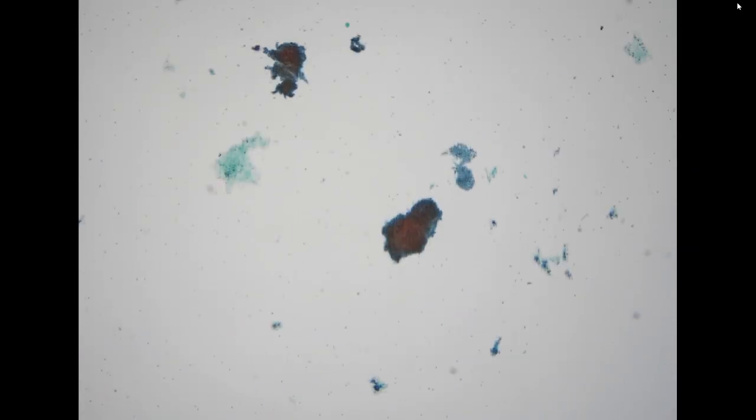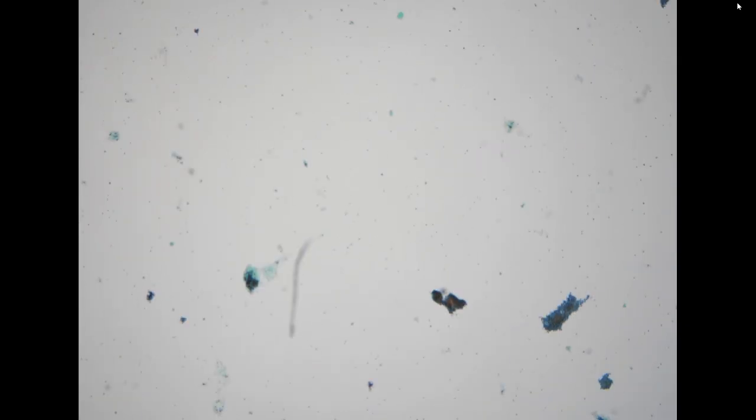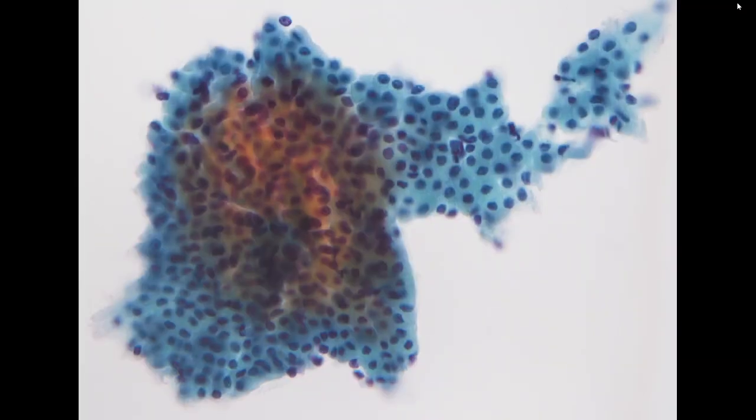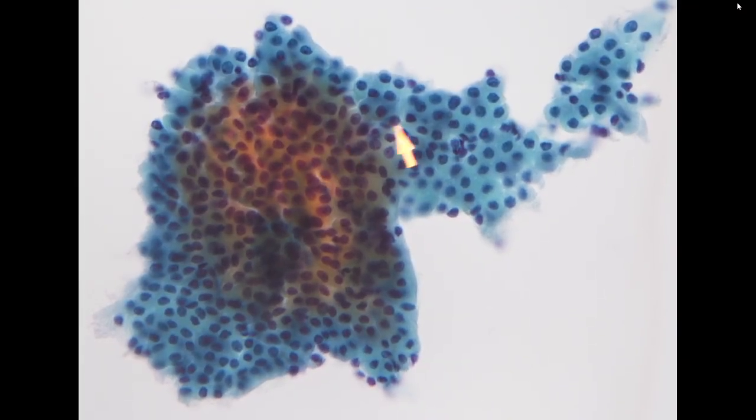So the next specimen is also from a parotid gland. Again, this is a hypercellular specimen. We see a lot of cellular fragments, and all these cellular fragments have these oncocytic features. You can appreciate it is still very uniform, but with a lot of cytoplasm.